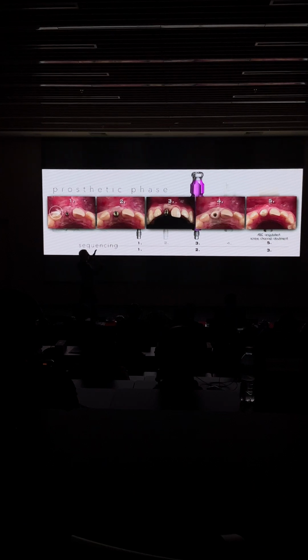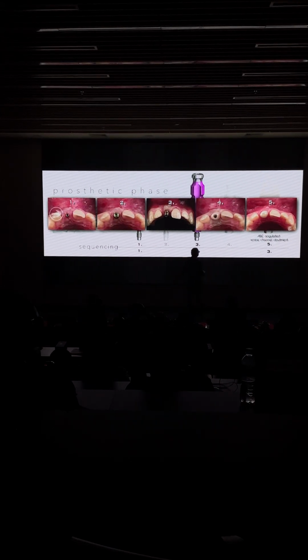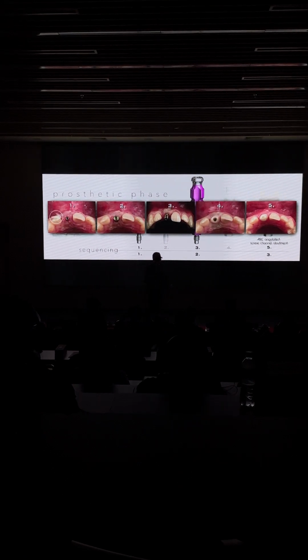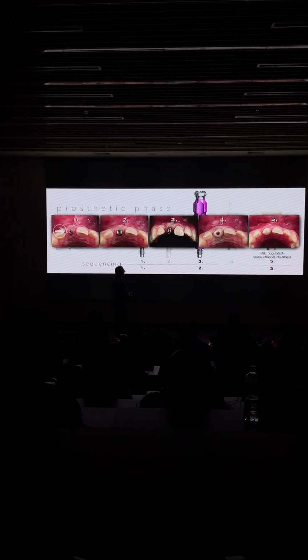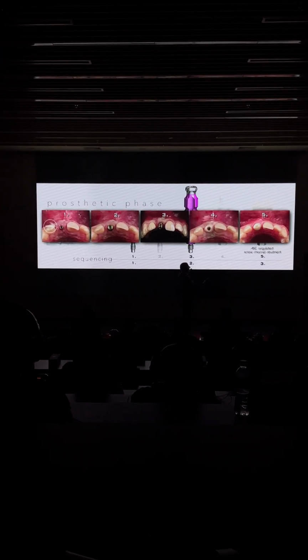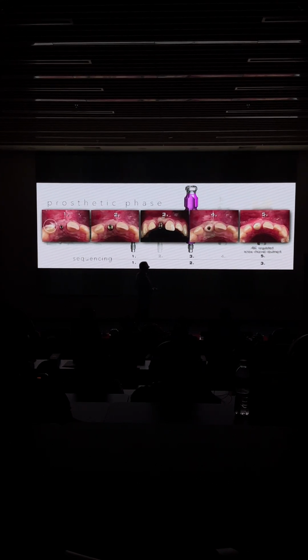The wider the healing abutment, the more the tissue will recede towards the apex and towards the center. So you will see your finishing line sticking out of the soft tissue. So don't worry. Okay? We'll show you how we fabricate these abutments in the lab, and you will see within a month, in 3 months, the tissue will follow the anatomy of what you have provided.